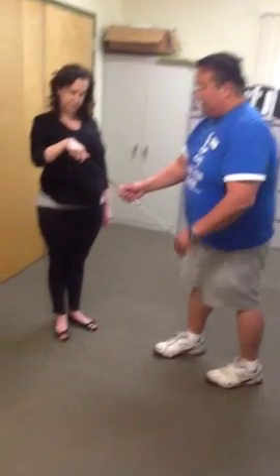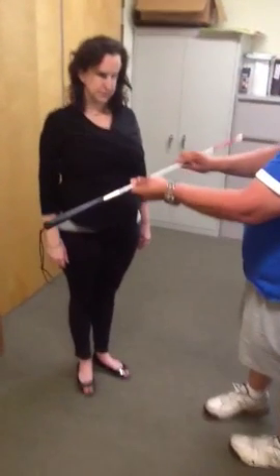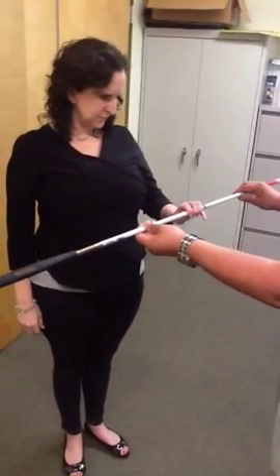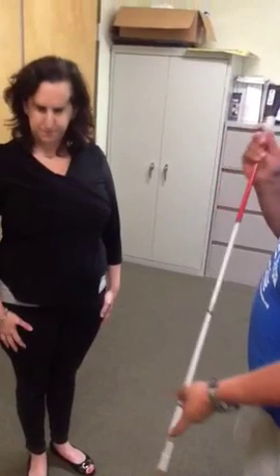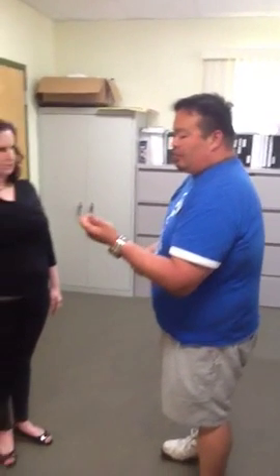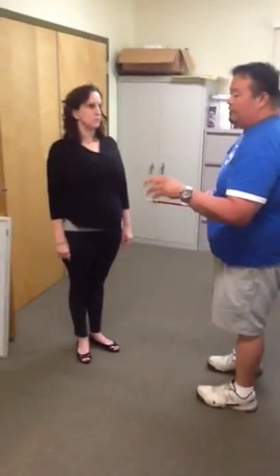Yes. Okay. The middle part, or the white part of the cane, is the shaft. So that's the shaft in the middle, and this is the tip at the very end. There are many different kinds of tips. There's a rolling tip, there's a ball tip. This is just a regular size tip that we use here.